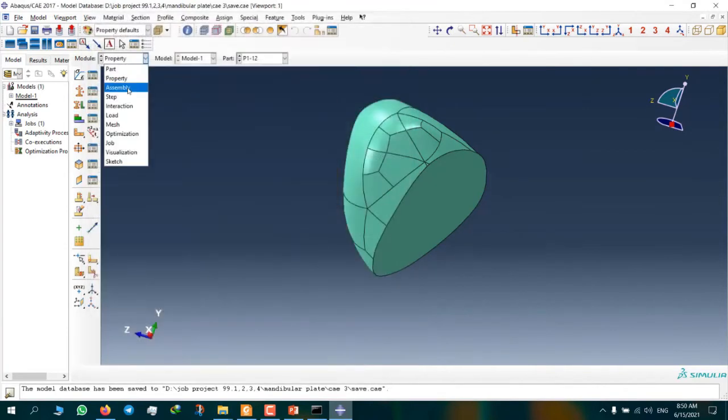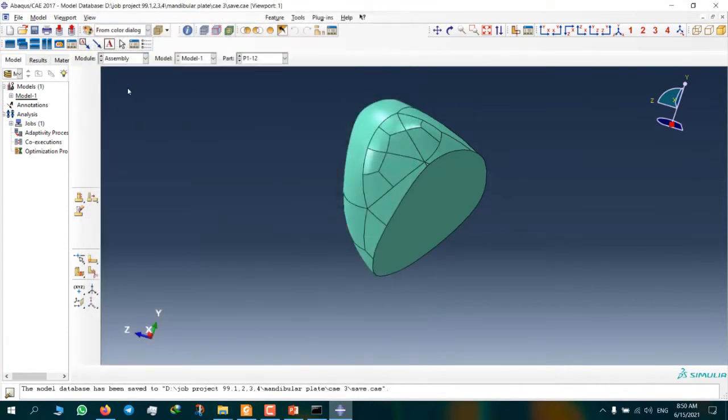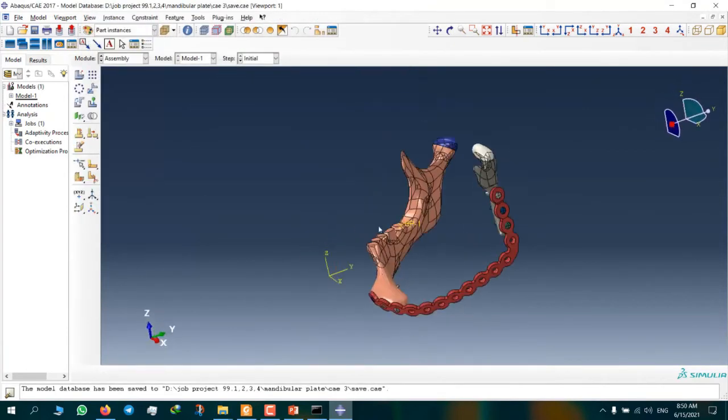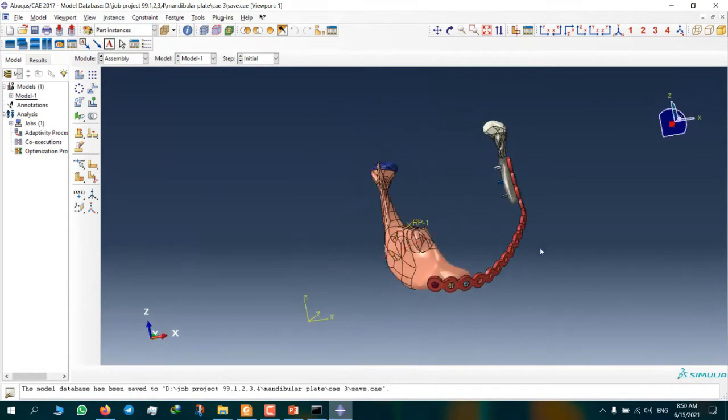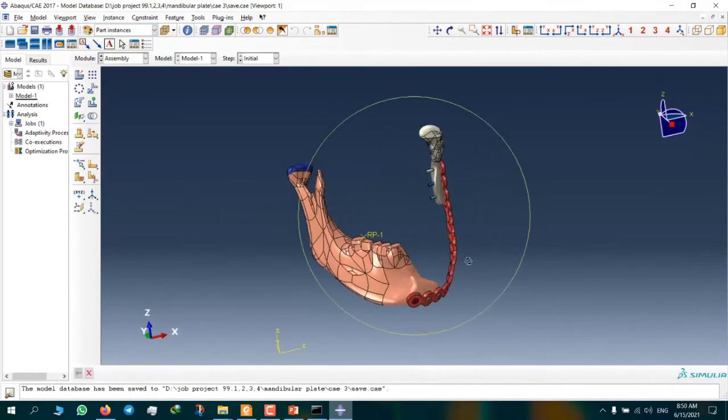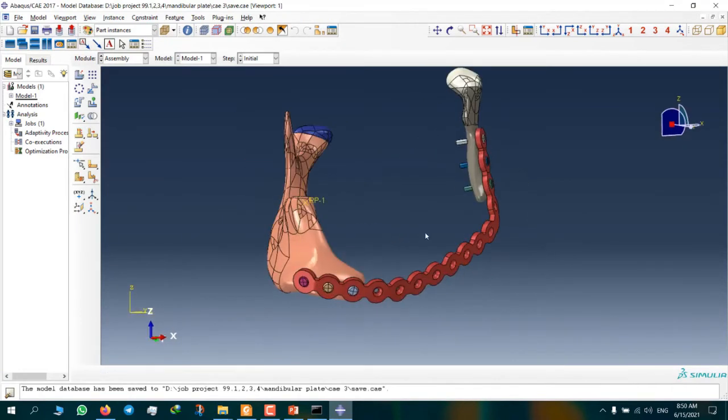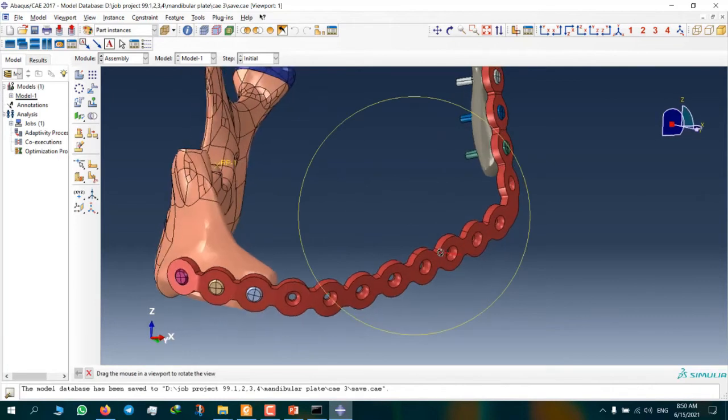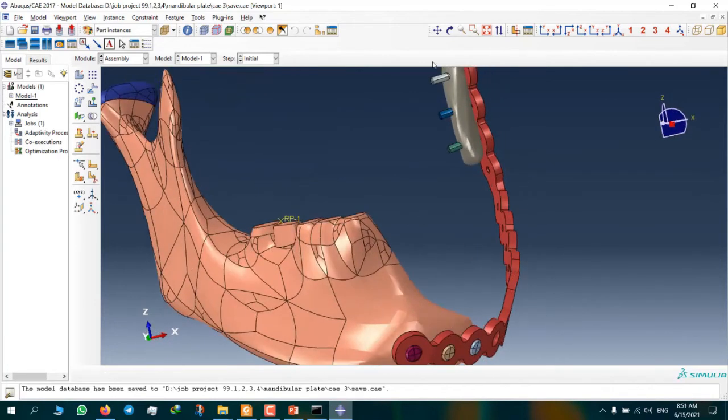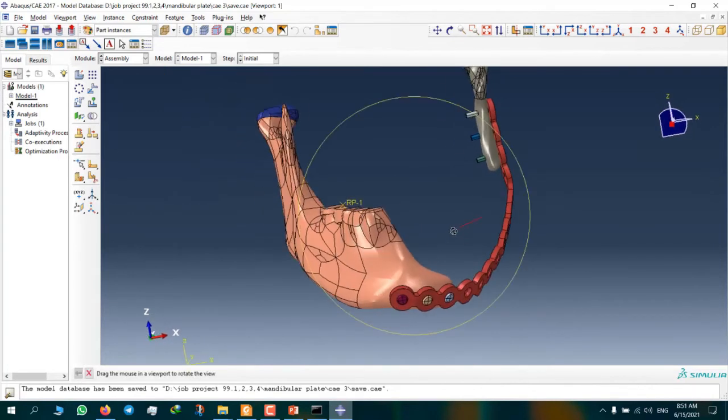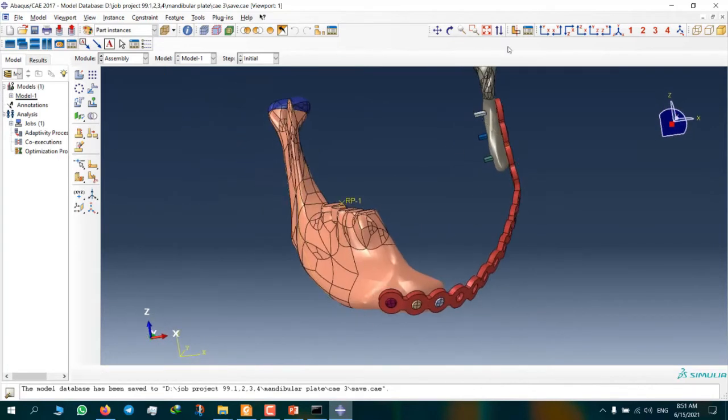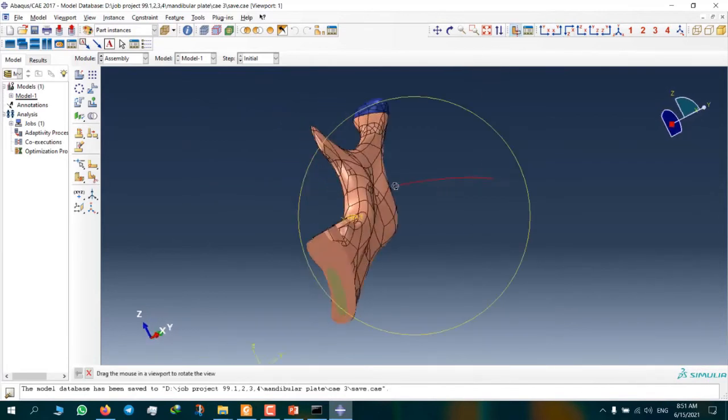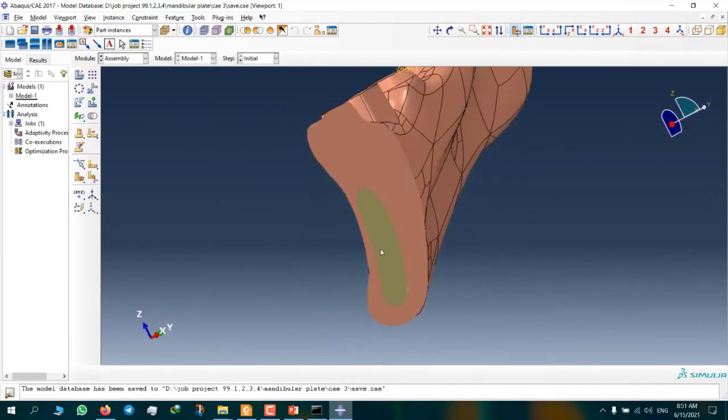Now here, this is our model, this is our plate, a mandibular plate, and these are screws. After that, I can show you this is a spongy bone.